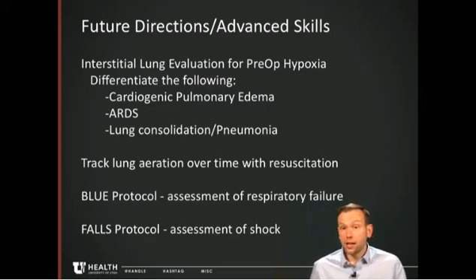You could track lung aeration by looking at the evolution of B lines as you resuscitate a patient, to see if your fluid's going into the vessels or ending up in their lungs. And then there's two protocols that I think are very interesting. The Blue protocol you may have heard of. This is an assessment of acute respiratory failure, and the Falls protocol, an assessment of shock, trying to utilize some of these things that we've seen.